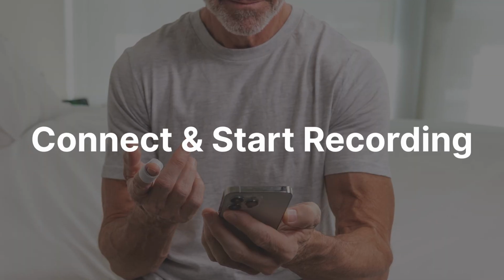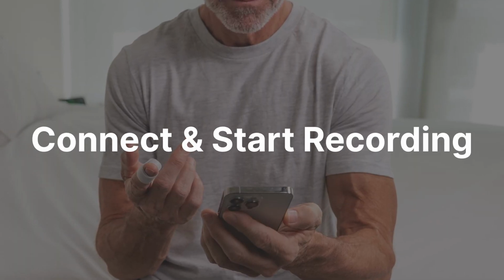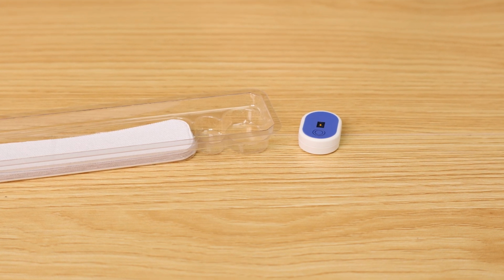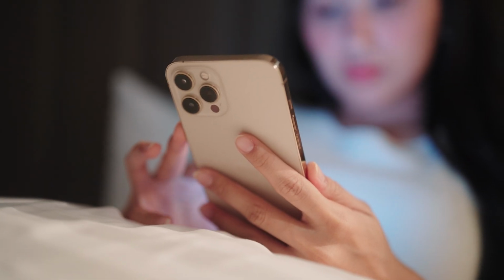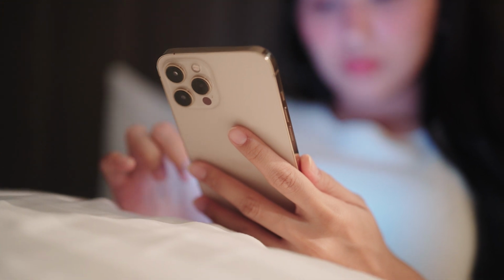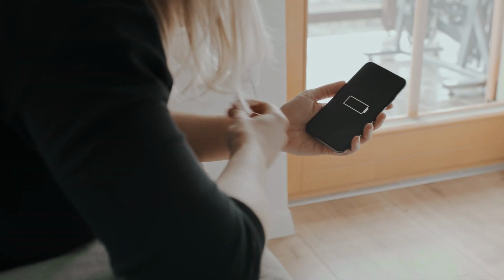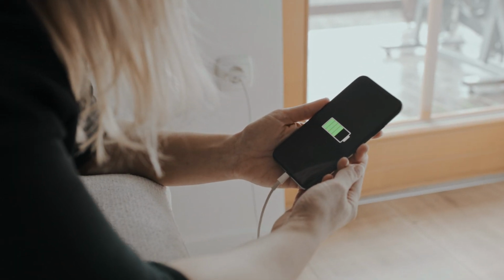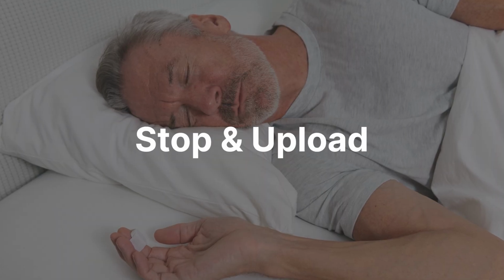Step 4. Connect and start recording. When you're ready for bed, press the small button on the sensor until you see a red blinking light. Open the NightOwl app, whether for iOS or Android, depending on your device, and follow the prompts to pair your device. When it says connected, tap start recording and go to sleep as you normally would. Important though, keep your phone plugged in and within 6 feet of you while you sleep so Bluetooth is always connected.